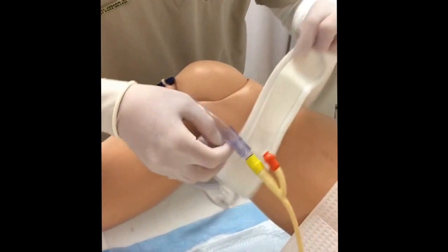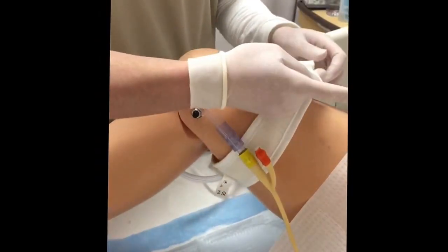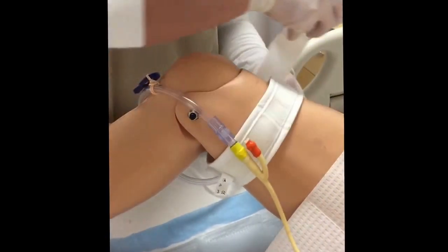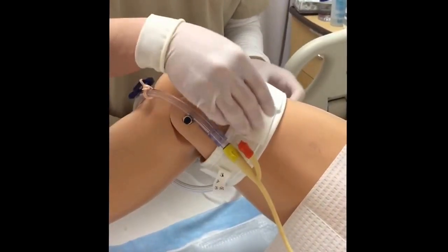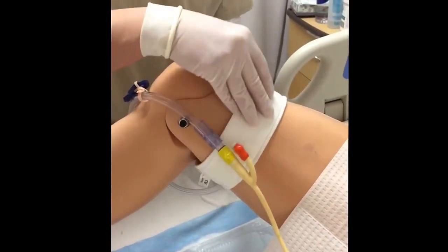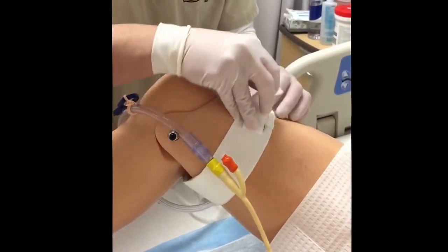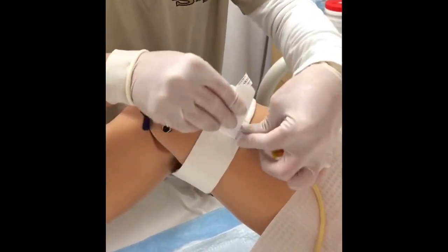So make sure that you're putting this here first. I just want to make sure not to do it in front of the patient, you know. Alright, I'm just going to unclip the bag. Make sure you adjust it. Is that okay? Make a note it's not too tight. Alright, now you can put this here. I don't see any bleeding. And are you feeling okay?